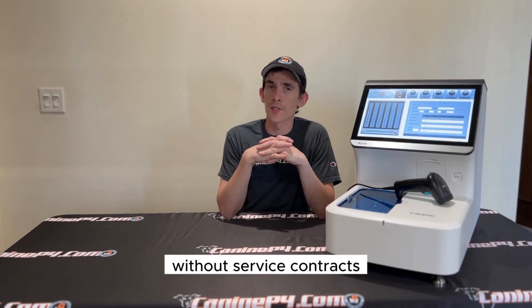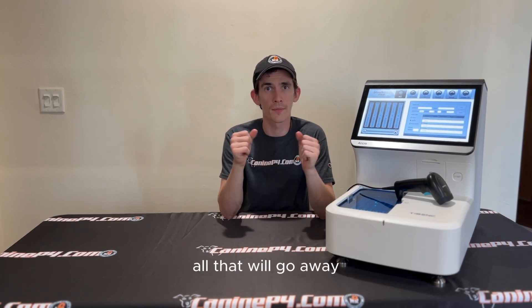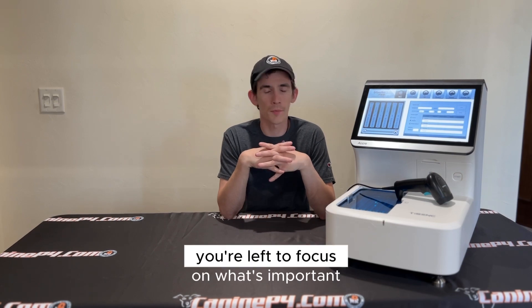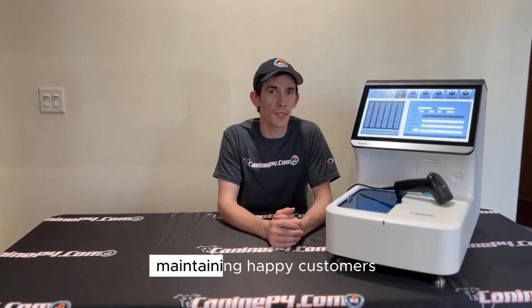Without service contracts, you're not stuck hassling, negotiating, or expecting higher re-up prices than you previously paid — all of that goes away. You're left to focus on what's important: running your clinic, getting your results out, and maintaining happy customers.